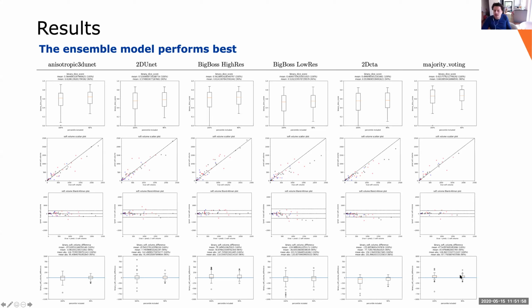And that's a typical case where you are still facing, let's say, insufficient data. Data would have probably improved the results as well, data accompanied by annotations. But in this case, we were able to boost our performance by averaging the models that were developed.